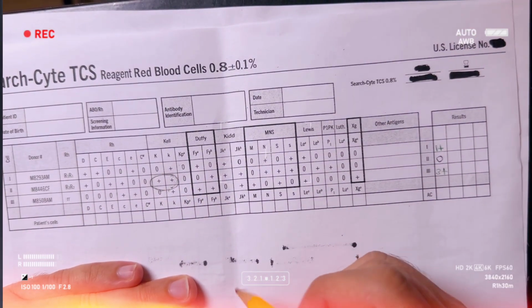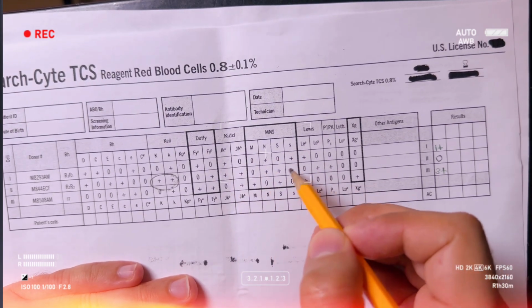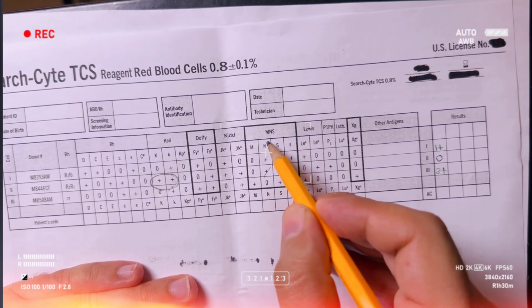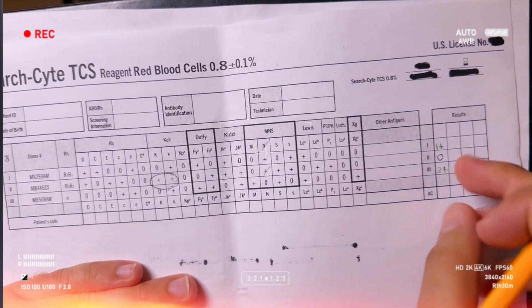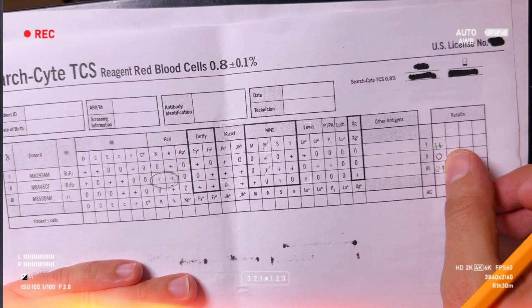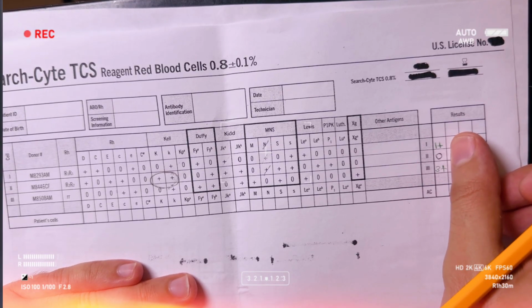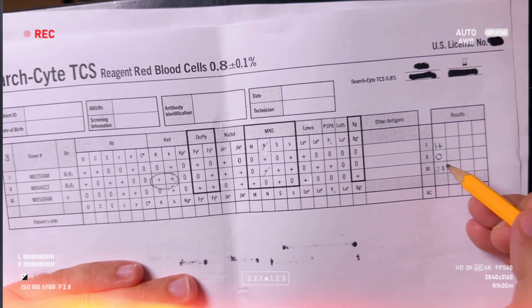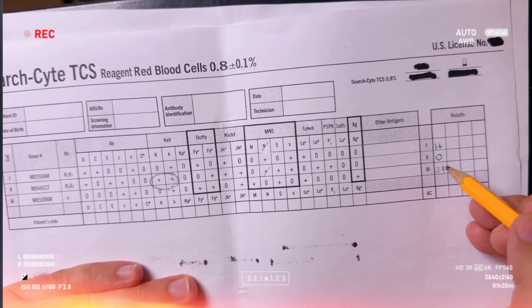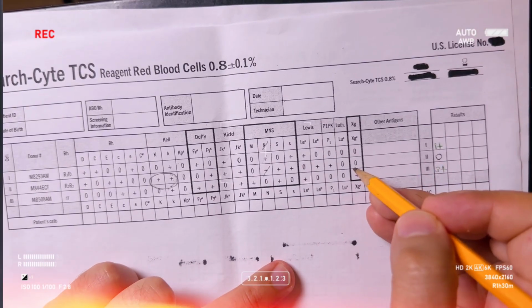Another important rule is that you can use 1 homozygous to rule out the specific antibody, like in the case of N. You have to use only the 0 reaction, not the 1, 2, or 3 plus, because those reactions are already positive. So all you have to use is the 0 reaction that you have. I'm going to use my 0 cell and go through each point.